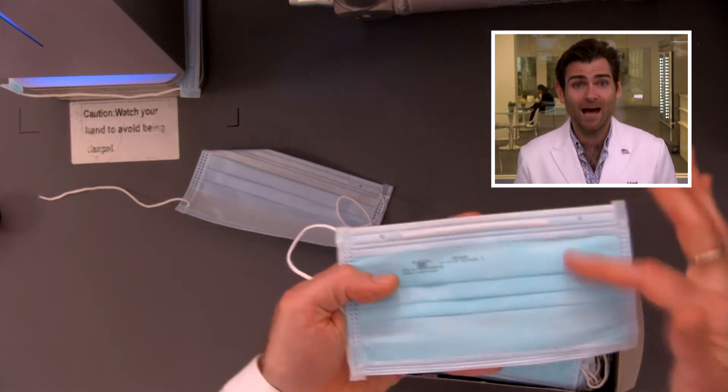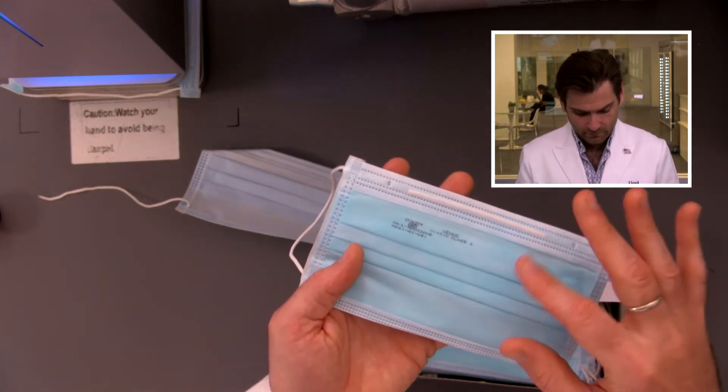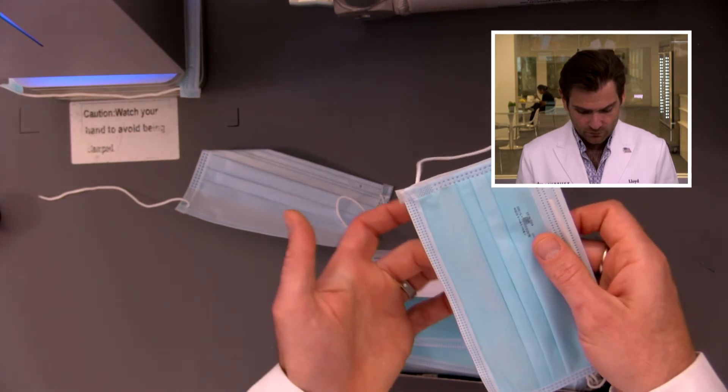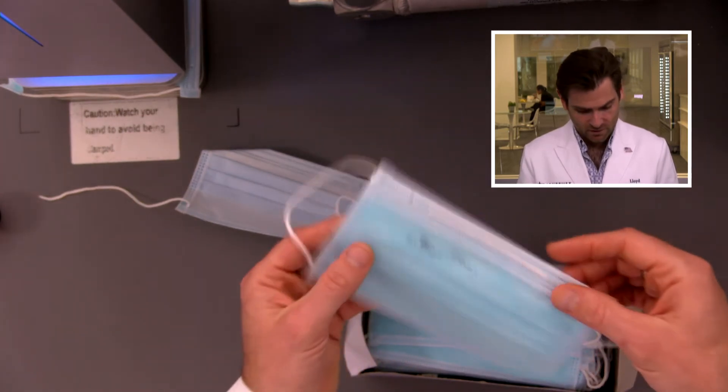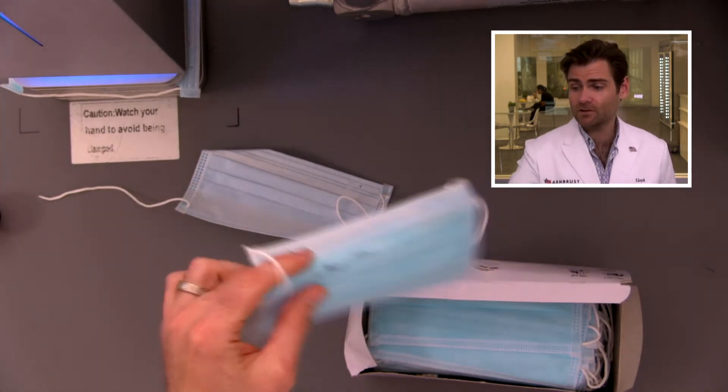The outer and inner layer spun bond is what protects you against water. The quality of the spun bond is great, but I can see through it a little bit, so I can tell the melt-blown is not great. The construction seems pretty good overall, though.